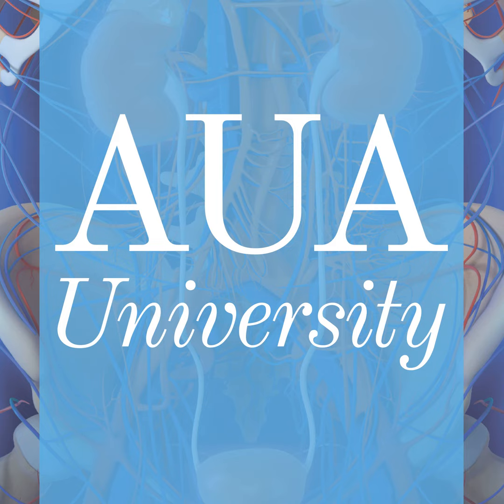If the patient has undergone any type of brachytherapy, you will expect a high fibrosis in the area of the apex and in the area of the rectum, which also differs dependent on the type of radiation therapy. And I guess that's the bottom line message.